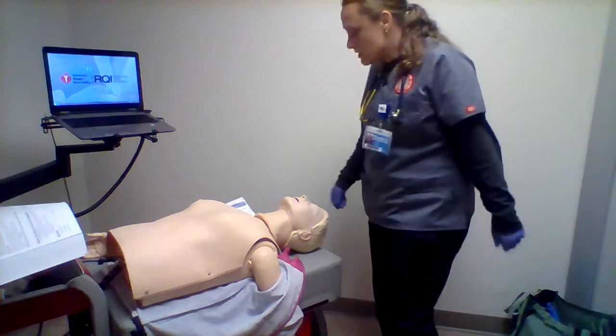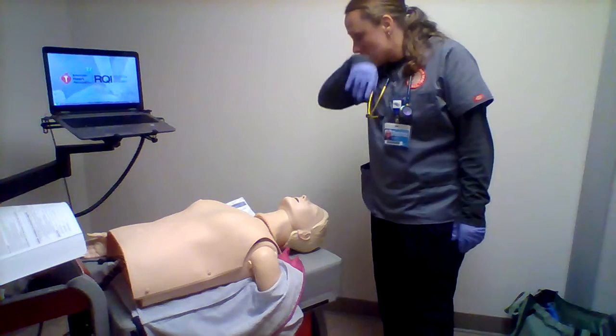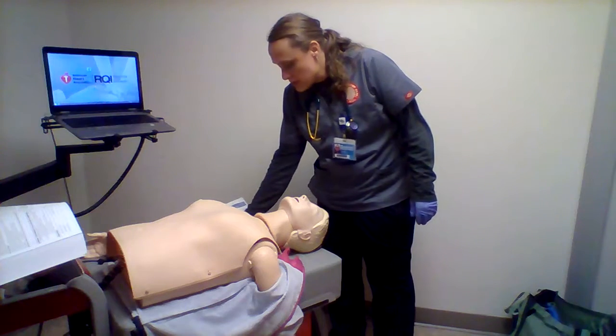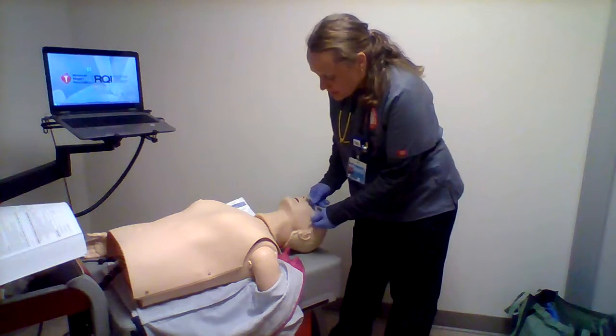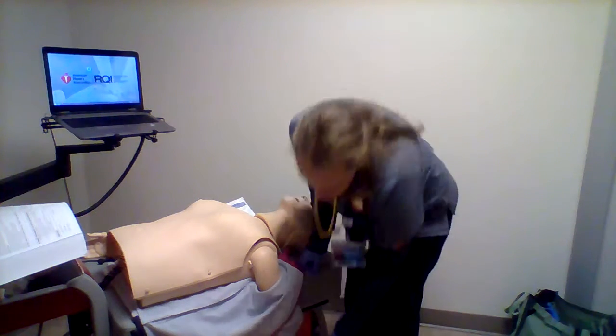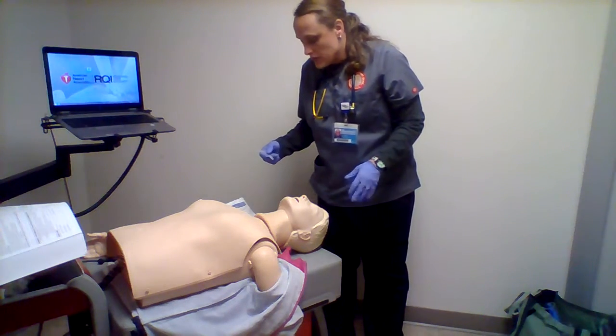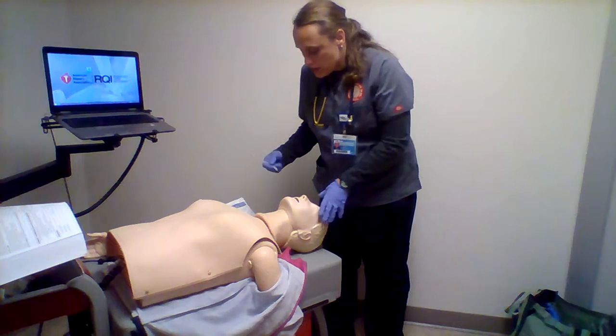Mr. Jones, the doctor has ordered some suctioning for you to help you get rid of some of that secretion in your lungs. So the first thing we're going to do is put a little airway in your nose to help us get to those secretions without causing you any problems, because it could cause you to nosebleed if we keep doing that really often.